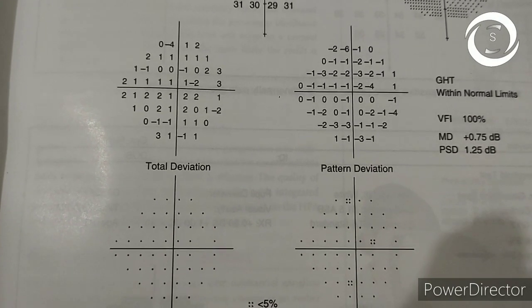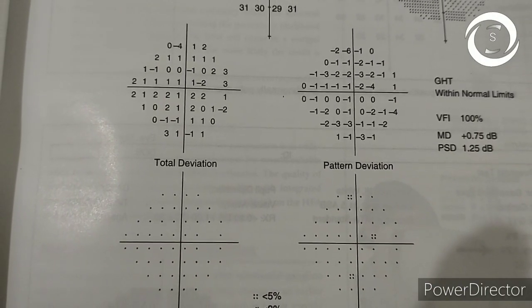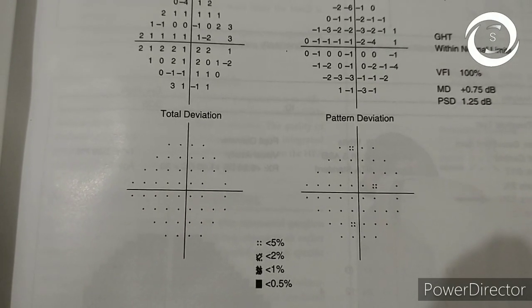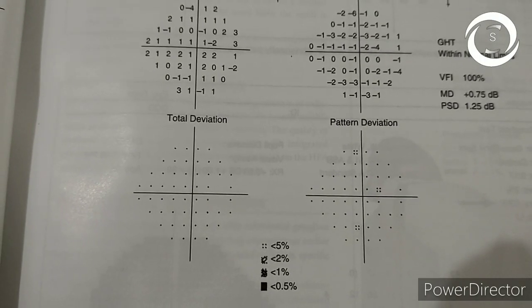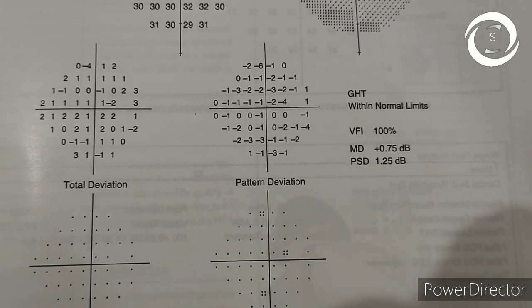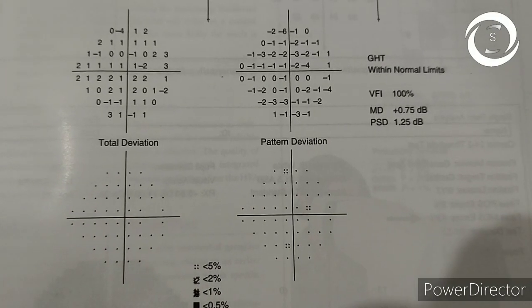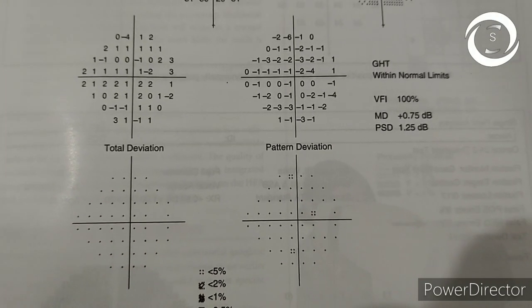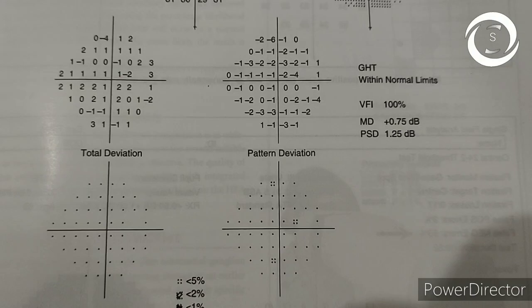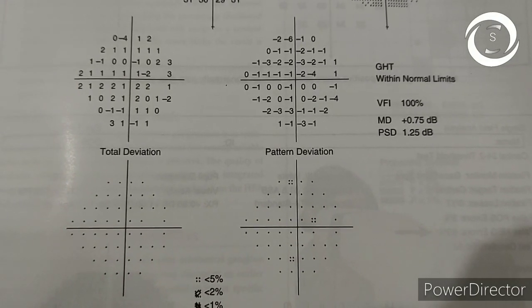You can see the total deviation is almost normal — there are no dark squares. If you come to the pattern deviation, it is also almost just like the total deviation, meaning there is no generalized depression. This represents the true visual field. The glaucoma hemifield test is within normal limits, mean deviation is +0.75, and pattern standard deviation is 1.25.